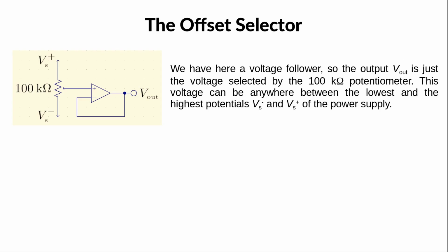The offset selector is optional. It allows us to shift the output voltage up or down, depending on the requirements of the electronic device that we want to control. We have here a voltage follower, so the output Vout is just the voltage selected by the potentiometer. This voltage can be adjusted from the lowest potential to the highest potential of the power supply.